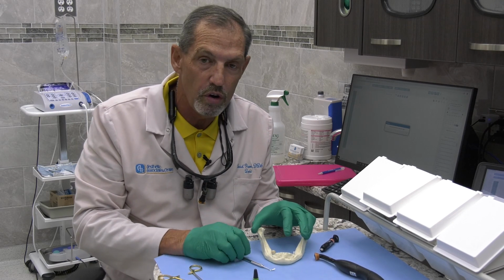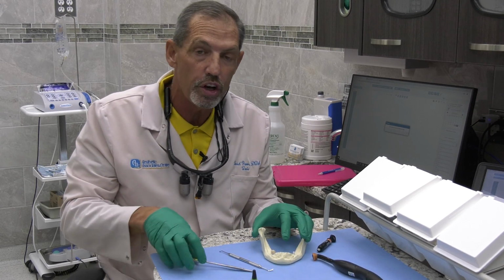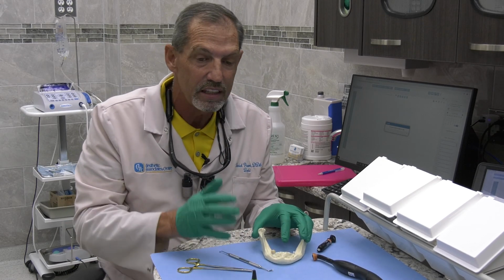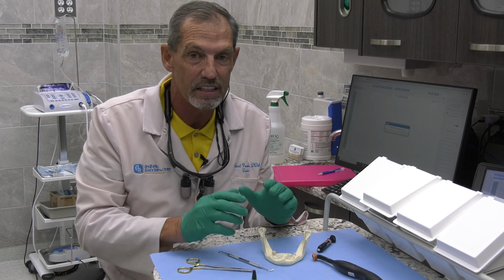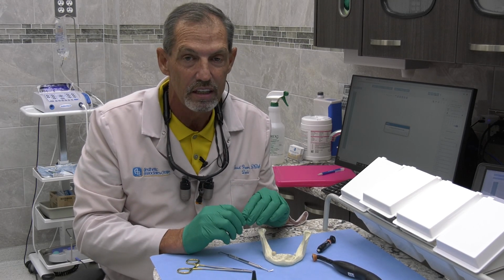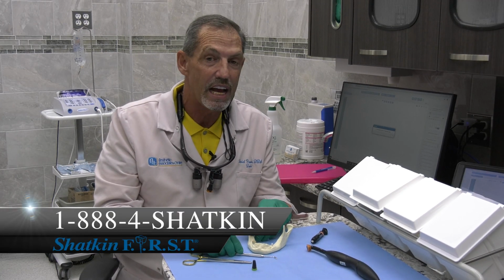The way these are removed when the patient comes back, you can either use a hemostat to remove it, or you can cut them in half and just pop them off like you would a regular temporary. This makes it a lot easier to make your temporaries in the mouth directly rather than relying on a prefabricated type of temporary.